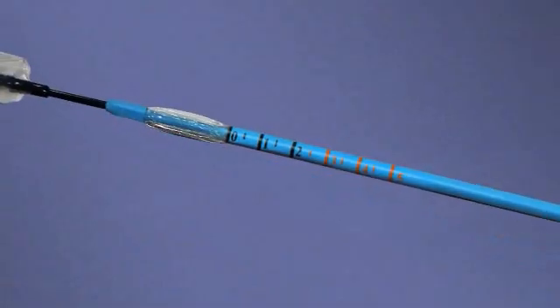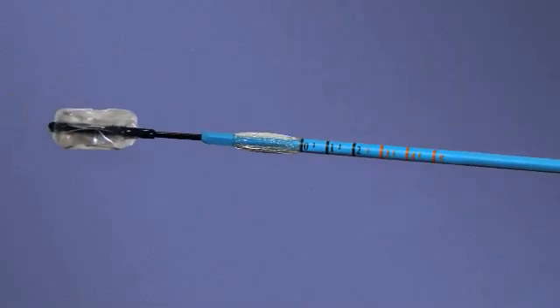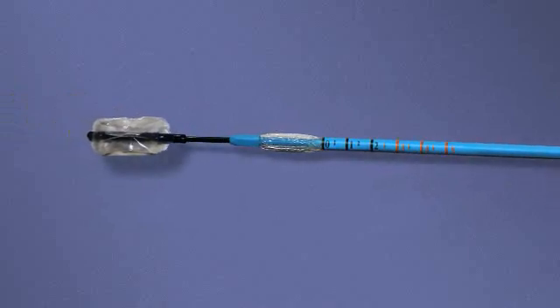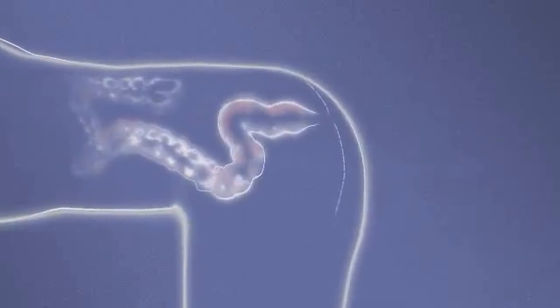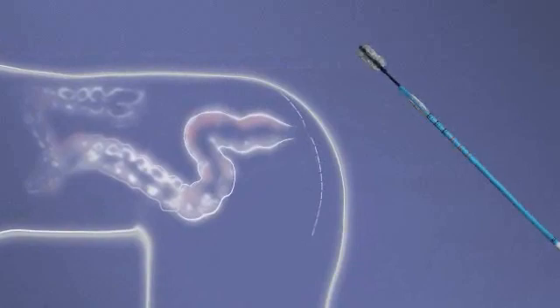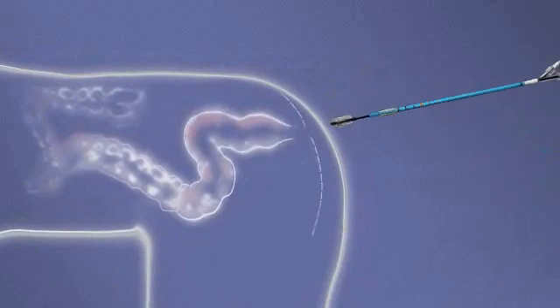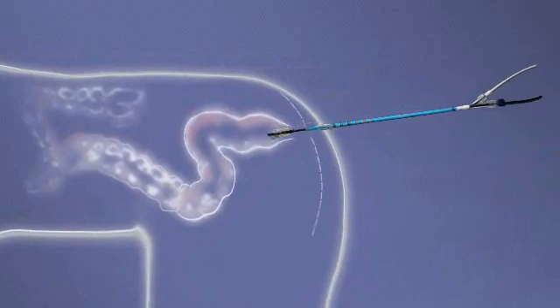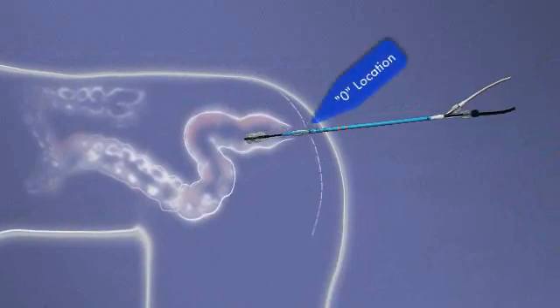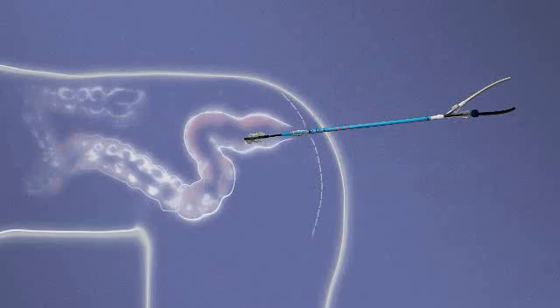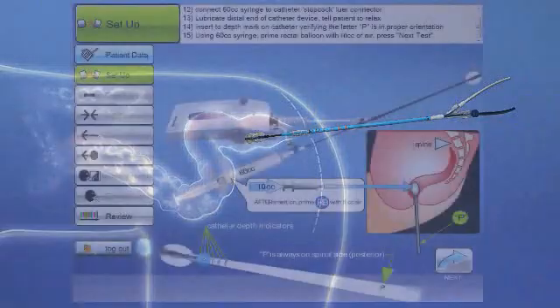As the graphic shows, there are indicator lines on the catheter. They start at zero, then go to one, two, three, four, and five. With a typical patient, the four anal canal balloons should be just inside the anal verge at catheter position zero. Anal canals range between 20 millimeters and 45 millimeters in length.